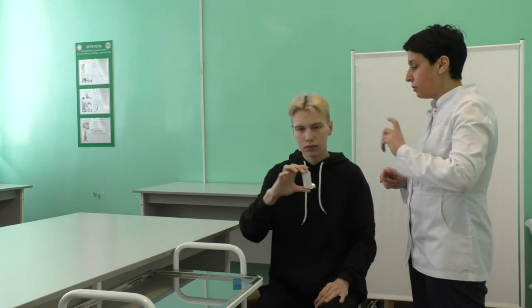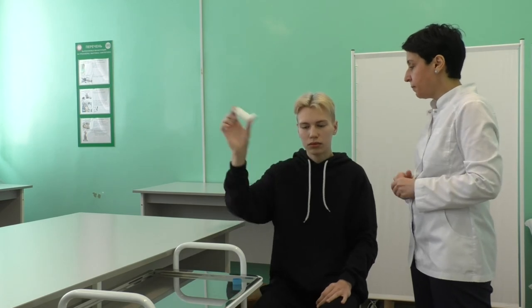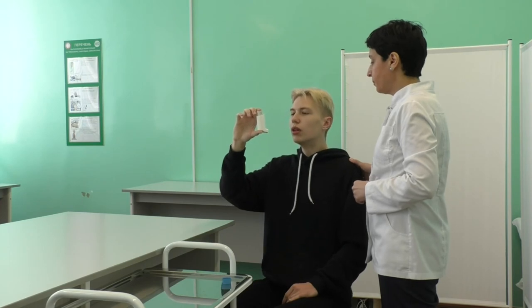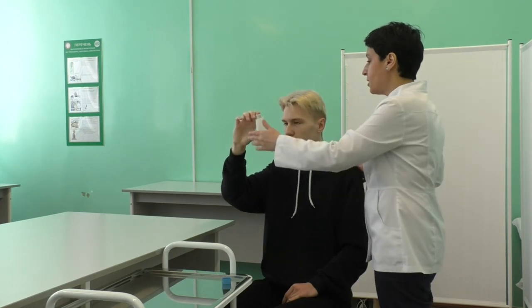The patient should shake the inhaler for 5 seconds. Propose your patient to take a deep breath and fix the mouthpiece with the lips, and after that you can observe for your patient.